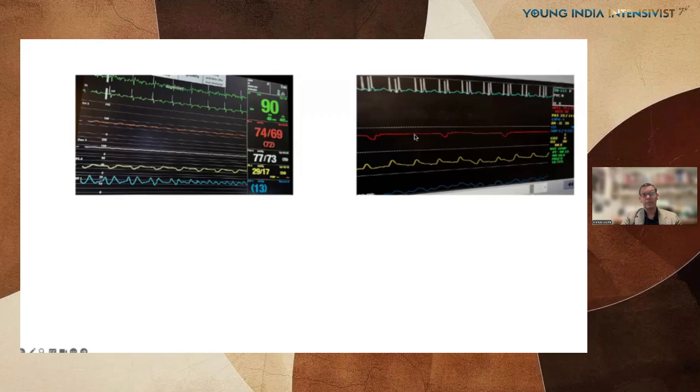This is a patient with relatively normal PA and CVP waveforms. The arterial waveform is non-pulsatile with these regular dips. This is a patient with a HeartMate 3 LVAD, because the HeartMate 3 is designed to create a pseudo-pulsatility, a sort of drop in flow every 2 seconds.